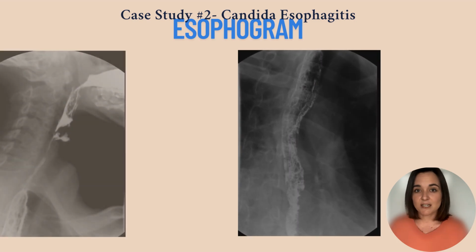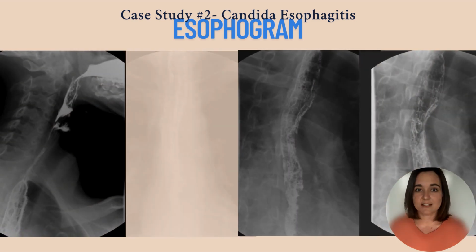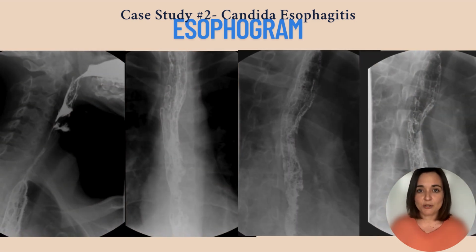Next up is a case study which shows us Candida esophagitis. A patient with advanced immunosuppression presents with odynophagia during the esophagram, specifically in the RAO view. Multiple irregular plaque-like filling defects are noticed along the esophageal mucosa. This is a textbook case of Candida esophagitis.